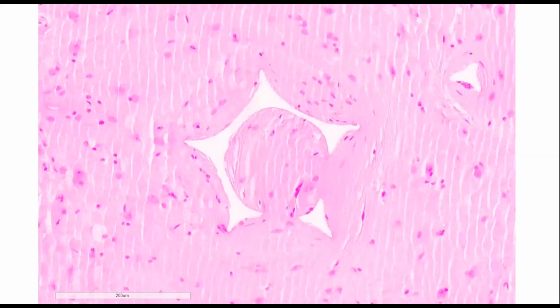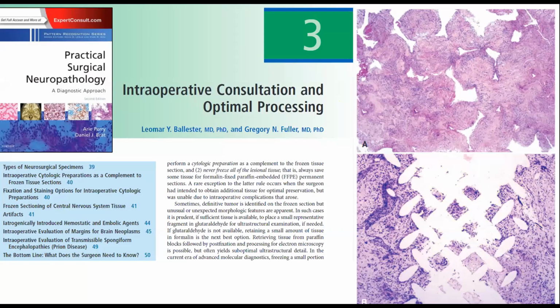Whenever you see those sharp angles, triangles, that is blue sponge, and you can see how the tissue is distorted around them. I think this looks like the Lone Star State. I'm going to call this Star of Texas. Isn't that just great? Yeah, I like that. Okay, blue sponge artifact.